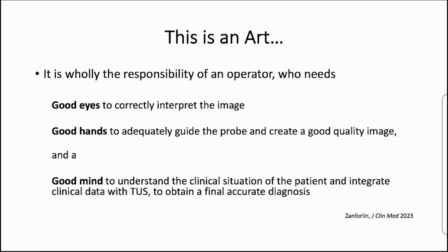Thoracic ultrasonography is an art. It is not a single day's procedure. I always say: see one, do one, and teach one. It is wholly the responsibility of an operator who needs good eyes to correctly interpret an image, good hands to adequately guide the probe and create a good quality image, and a good mind who knows the pathology, understands the clinical situation of the patient, and integrates the clinical data with ultrasonography to obtain the final accurate diagnosis of the patient. So this is my last slide, and this is Professor Jose Chaco.